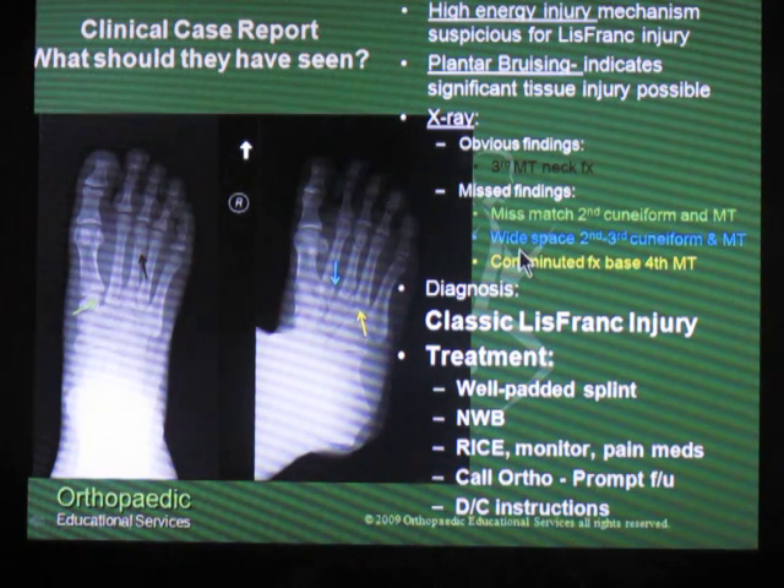The next thing that they should have seen — the blue arrow — was a widening in the space between the second and third metatarsal shaft, and again in the second and third cuneiform. This is also a giveaway for having a Lisfranc injury. And then lastly, the yellow arrow shows that they had a comminuted fracture at the base of the fourth metatarsal shaft.